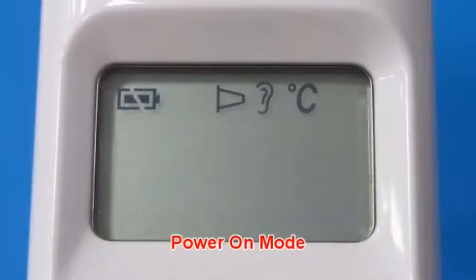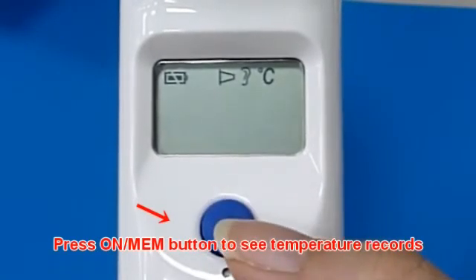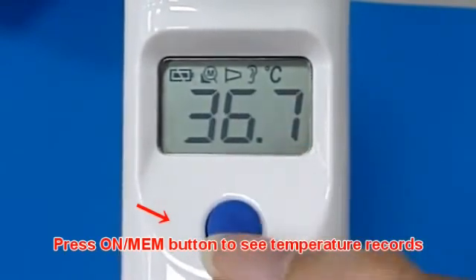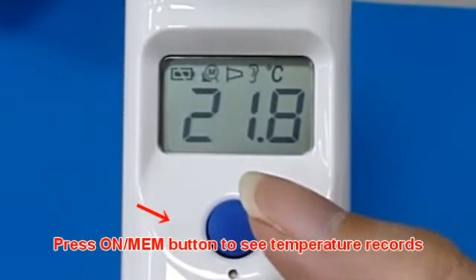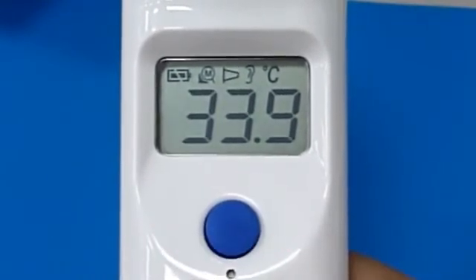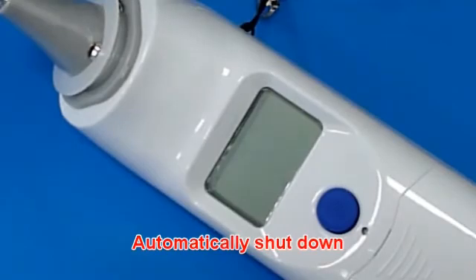In power on mode, the thermometer records the last measurement data before power off. Press the memory button to see the temperature record. The device will automatically shut down after 1 minute of inactivity to extend battery life.